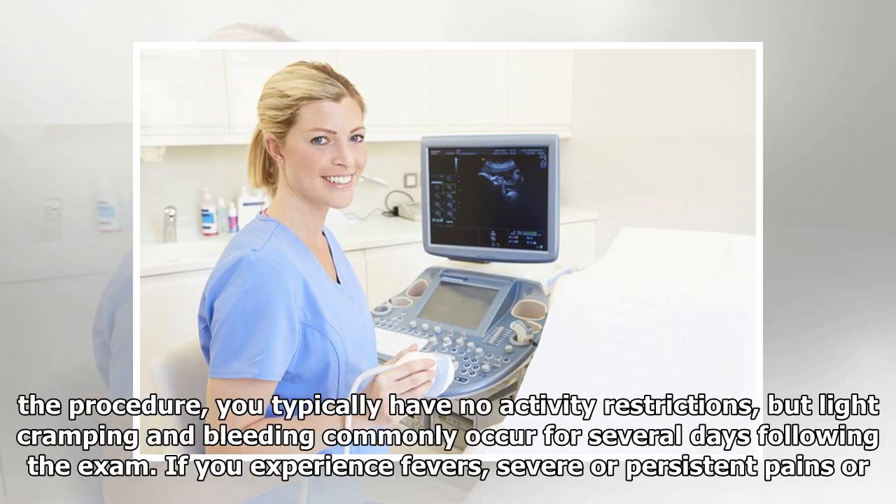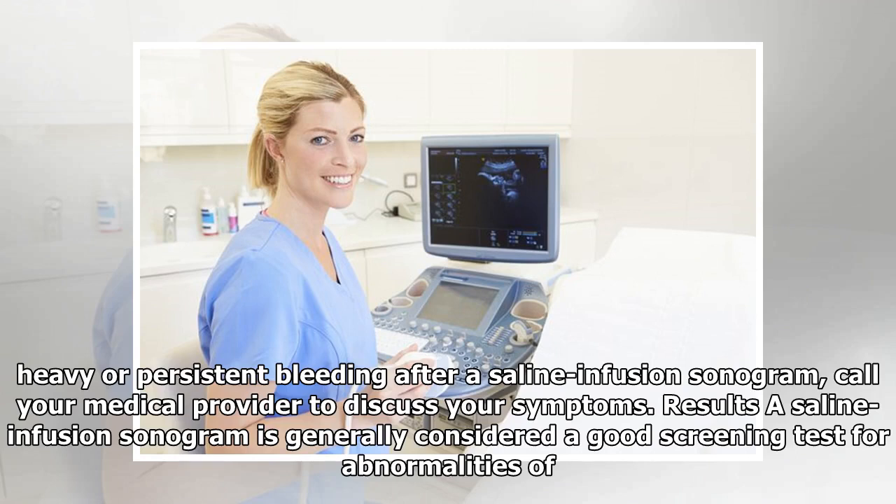After the procedure, you typically have no activity restrictions, but light cramping and bleeding commonly occur for several days following the exam. If you experience fevers, severe or persistent pain, or heavy or persistent bleeding after a saline infusion sonogram, call your medical provider to discuss your symptoms.